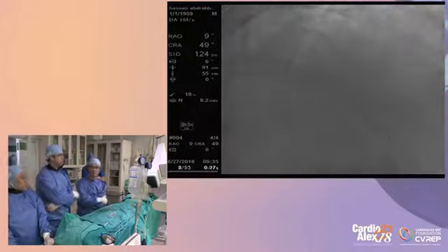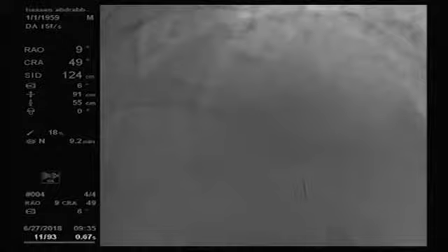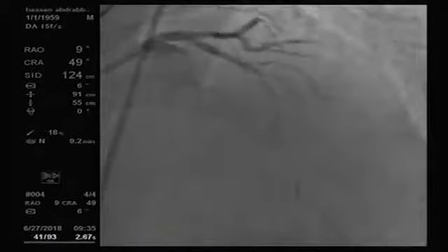Can we show the IVUS? IVUS, please. We already did IVUS. Okay, right now.